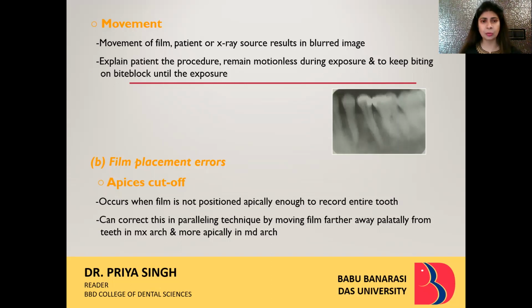Even the patient should not move throughout the procedure, even for milliseconds. The X-ray source has to be kept stabilized, and this has to be done by the technician who's taking the radiograph. So even the source should be very stable. Otherwise, the movement of the image receptor, patient or X-ray source might result in a blurred image. We have to explain to the patient the whole procedure, the time taken, and that if anything goes wrong, a second attempt has to be done.